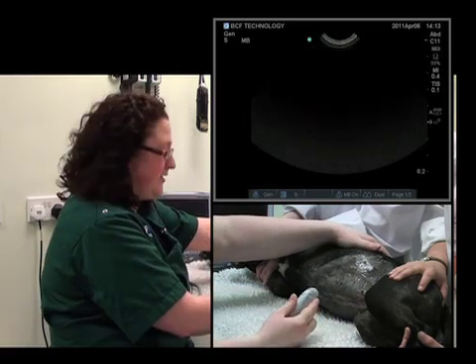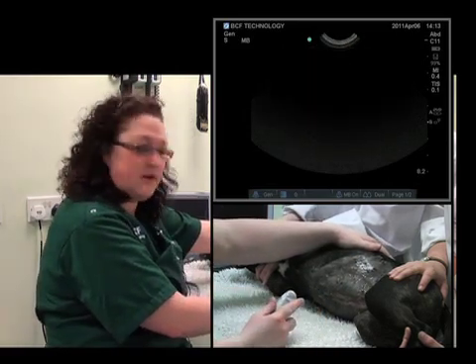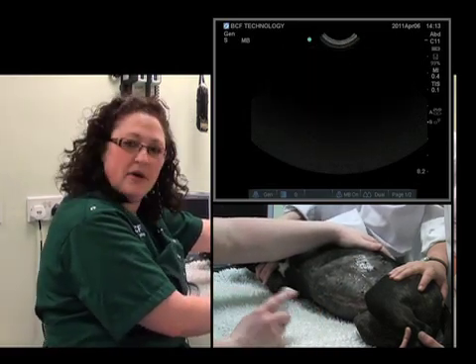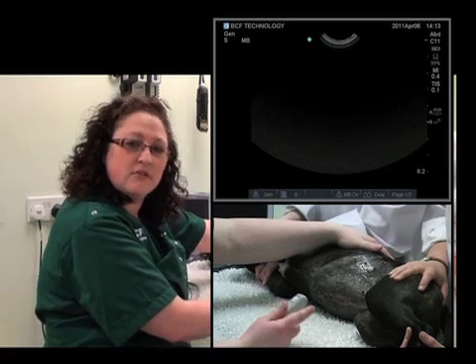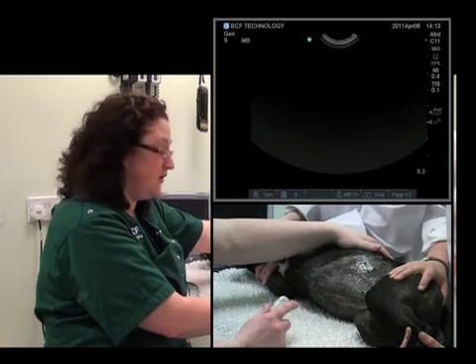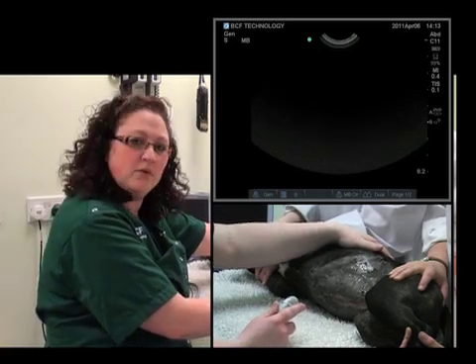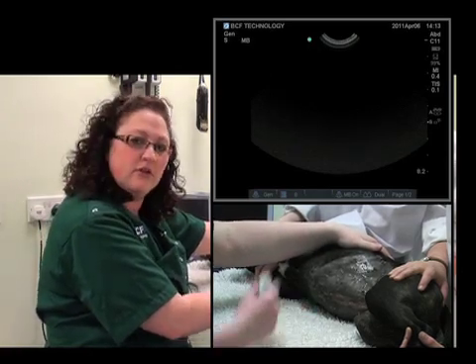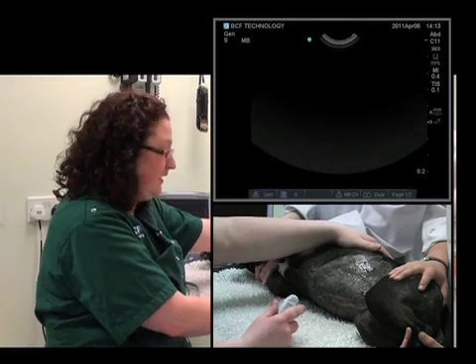Now we've seen the stomach. We'll move on to the small intestine. The best way to evaluate the small intestine is not to go through every single loop — that would take quite a while. So what we'll actually do is get a general overview of the small intestine.